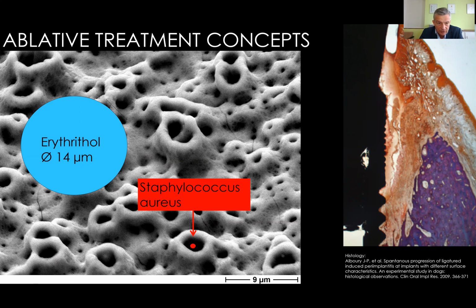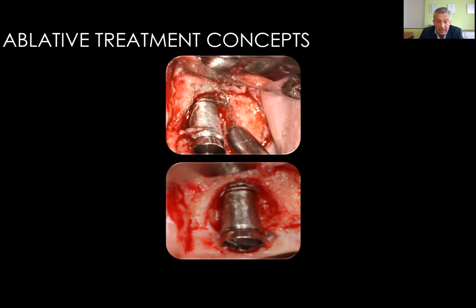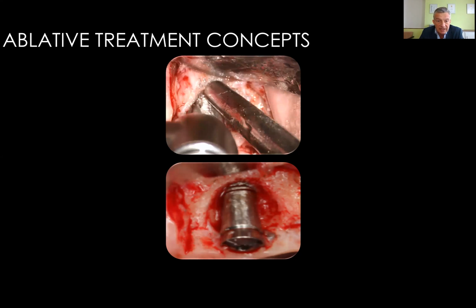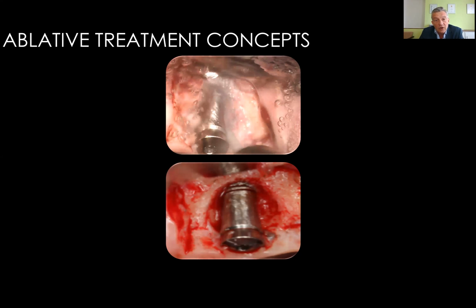And if you look at the microtexture of this implant, we have implant surfaces which allow the bacteria to hide in those surfaces. So it is not possible to clean the implants in an adequate manner. And if you're desperate enough, then you can polish the implant surface, you can grind everything away. And the disadvantages of those techniques are clear because we have a spread of titanium particles. We have the difficulty to clean the implant or to remove everything on the border to the bone. And the question is, do we achieve a re-osseointegration in these cases?